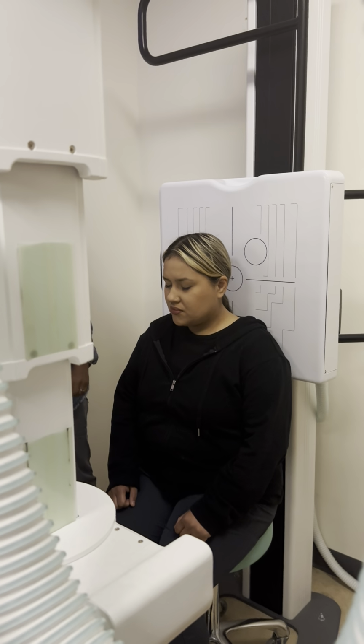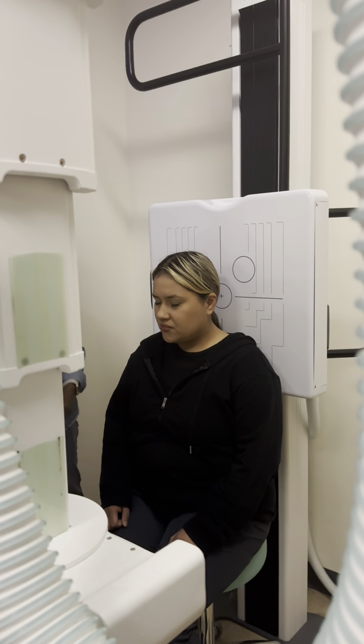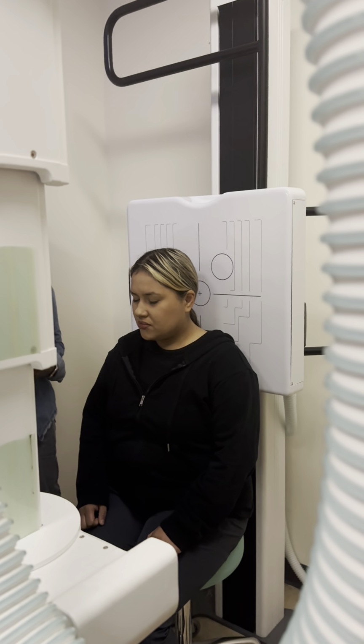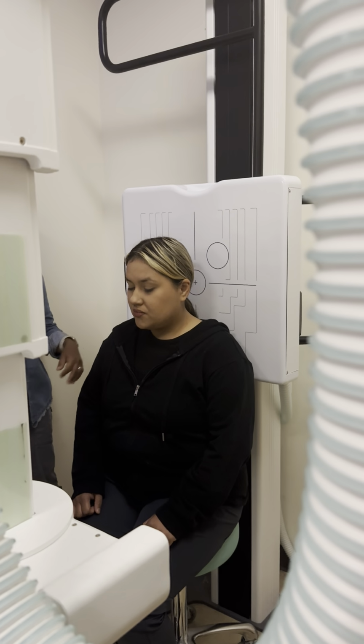So that's the general AP. The PA would be the same, except we would reverse it. We'd exit the Nasion, perpendicular, using the OML line. Can you show us them again? They're kind of confusing. Can you show us the PA again? Yeah, I'm going to.